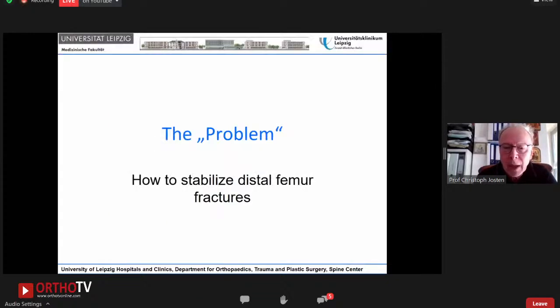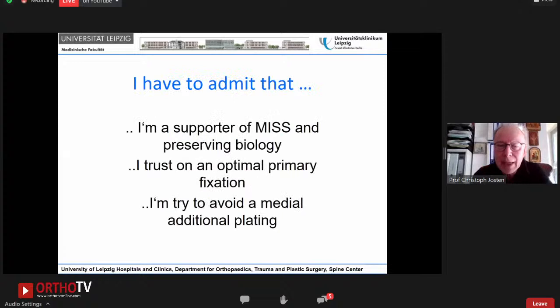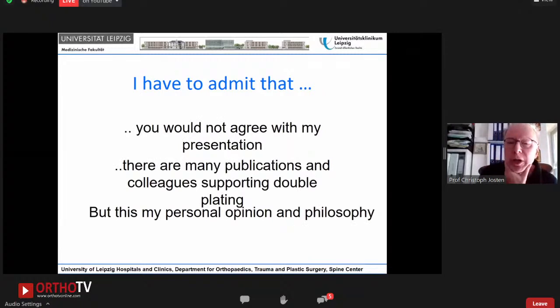But I have to talk about distal femur. The problem is how to stabilize a distal femur. I have to admit, I'm a strong supporter of MIS and preserving biology. I trust in optimal primary fixation. And I really try to avoid an additional medial plating. And I have to admit, many of you would not agree with my presentation. There are many publications and colleagues supporting double plating, especially in India. I know the fine book from Sunil Kulkarni and Babulka concerning the medial plating, but this is my personal opinion and also my personal philosophy.